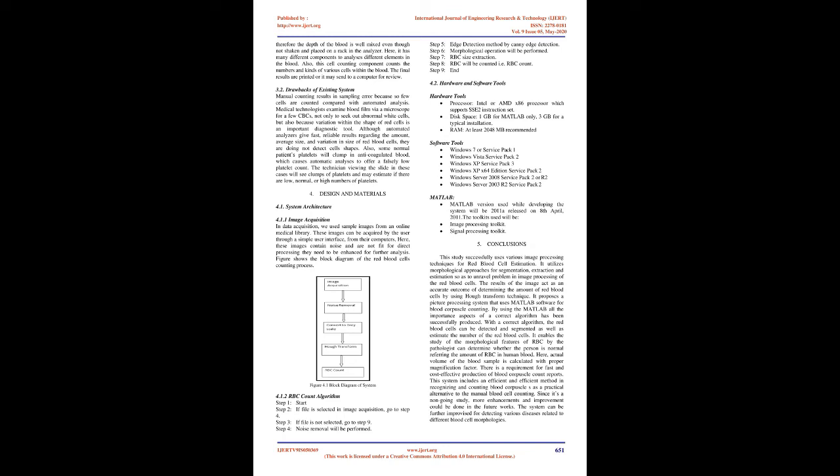Also, some normal patients' platelets will clump in anticoagulated blood, which causes automatic analyses to give a falsely low platelet count. The technician viewing the slide in these cases will see clumps of platelets and may estimate if there are low, normal, or high numbers of platelets.